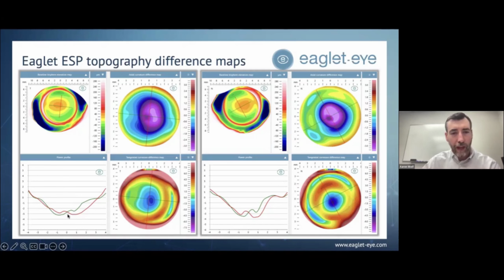The green and the red lines are just indicative of your primary meridians on the cornea. And both are, as you can see, coming down to around 3 to 3.25, which is what the power was of this particular patient. And then you can see the scale on the far left there. And then likewise, you can determine the width of your treatment according to the scale on the bottom, the x-axis. So the y-axis would be your power change, and the x-axis would be position on the cornea.